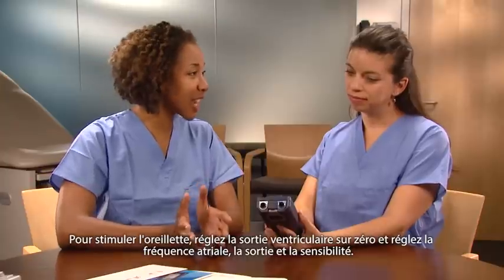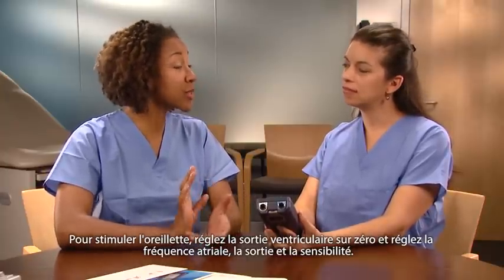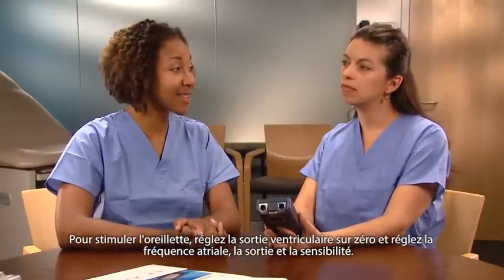To pace in the atrium, turn the ventricular output to 0, and adjust the atrial rate, output, and sensitivity.